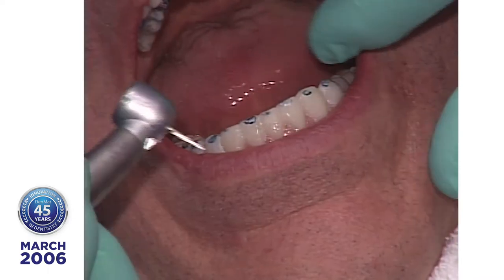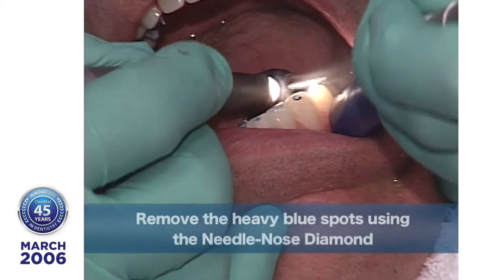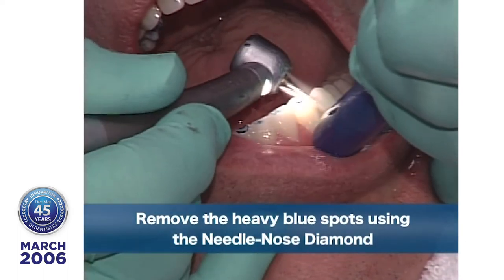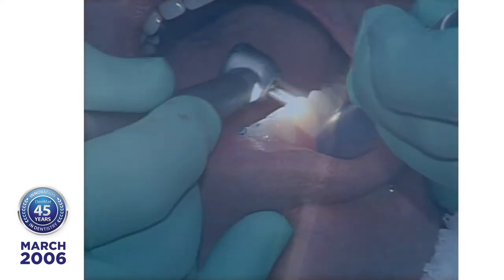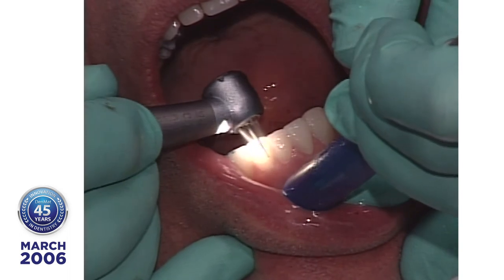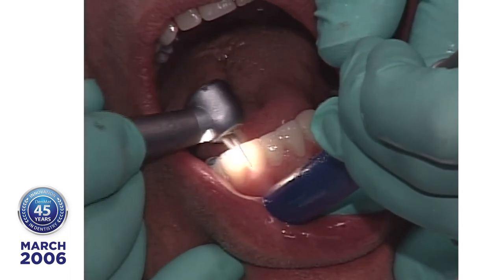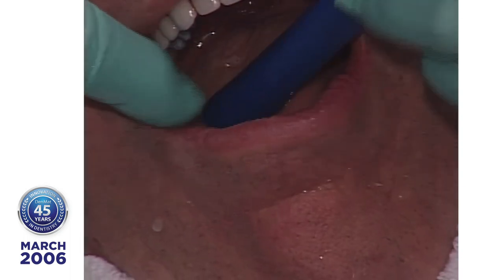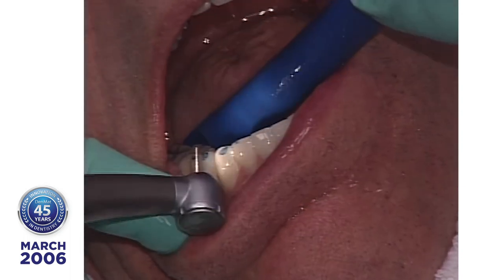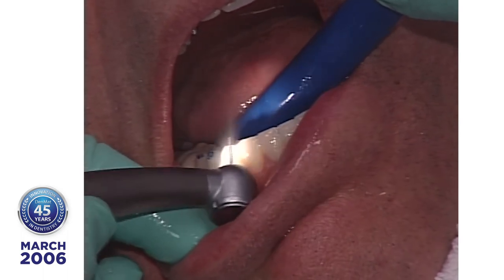Now let's go down here on the lower, open. And we start removing the heavy blue spots because you want to have a harmonious protected occlusion. Not sharp line angles on the incisal edges. And this is a spot where you want to spend a lot of time to prevent your lumineers from being fractured after you install them.